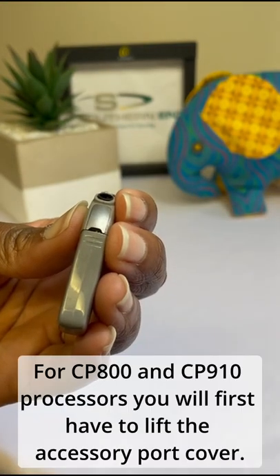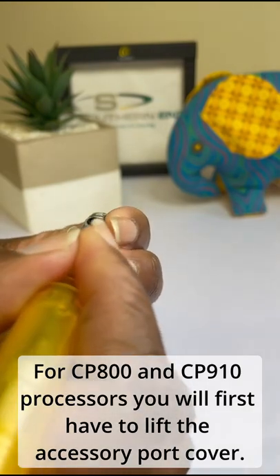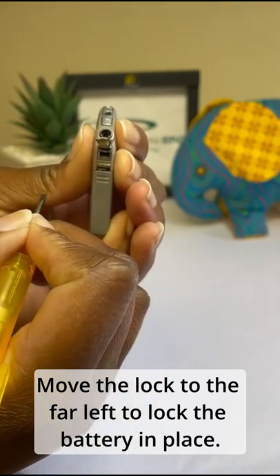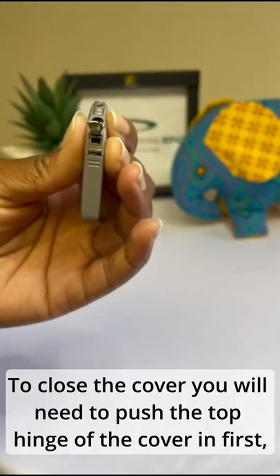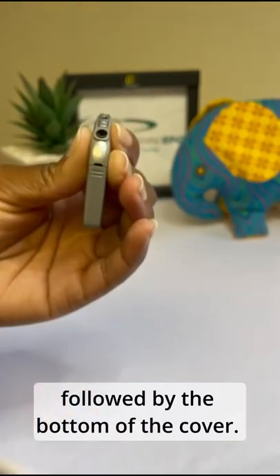For CP800 and CP910 processors, you will first have to lift the accessory port cover. Move the lock to the far left to lock the battery in place. To close the cover, you will need to push the top hinge of the cover in first, followed by the bottom of the cover.